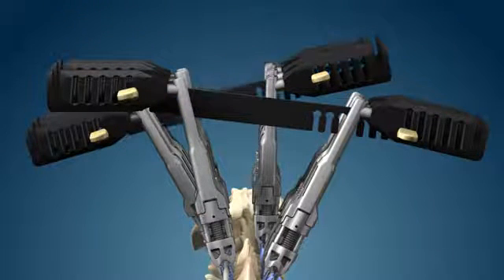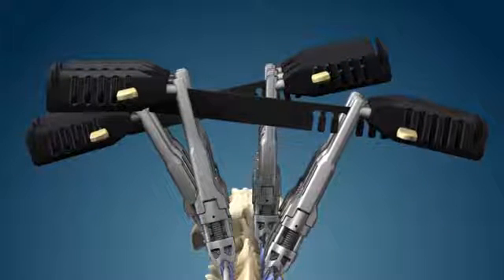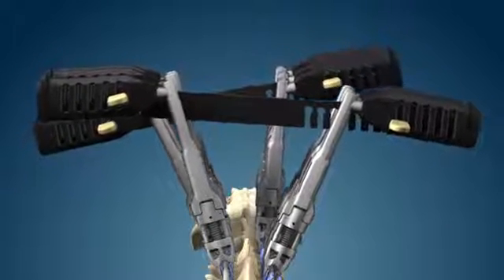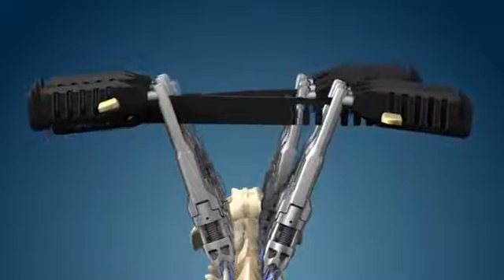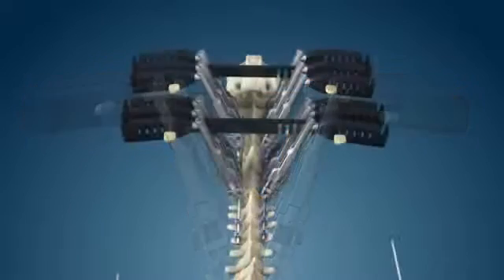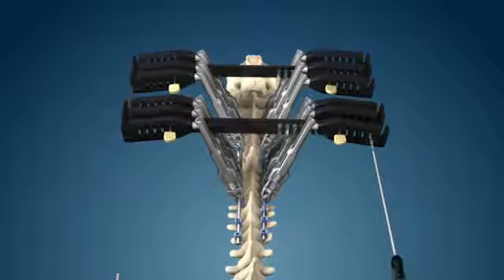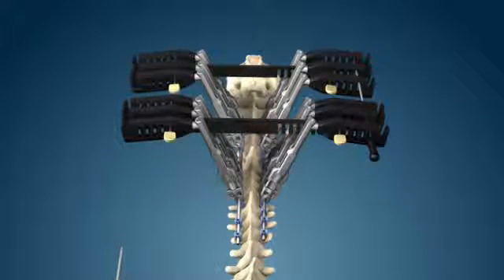The spine is derotated by slowly rotating the clusters in opposing directions over approximately 15 seconds. With desired axial plane correction achieved, cluster alignment rods are inserted to hold the correction in place. Holding a slight overcorrection will account for elastic rebound in the construct when instruments are removed.